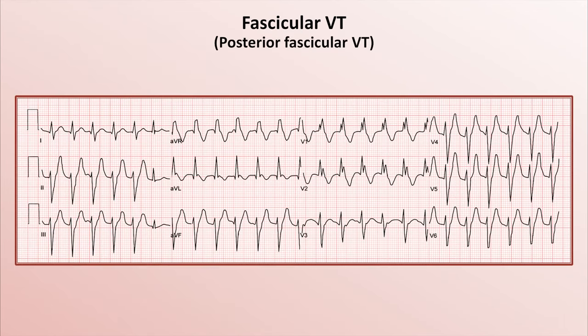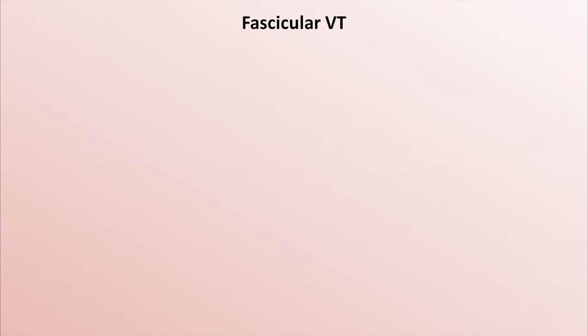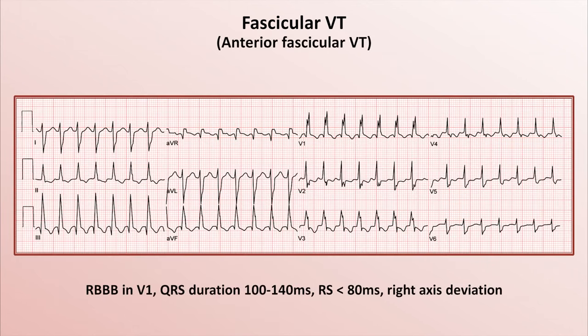Here's a posterior fascicular VT. We see a classic right bundle branch block pattern in V1, a relatively narrow QRS complex — in this case about 120 ms — the RS interval is under 80 ms, and there is a left axis deviation that's almost at negative 90 degrees. And here is an anterior fascicular VT that looks similar with the exception that the axis is now right deviated around positive 120 degrees.